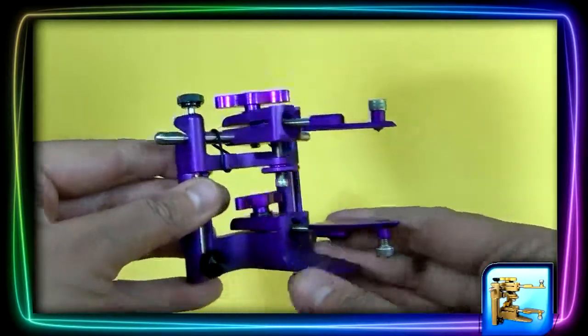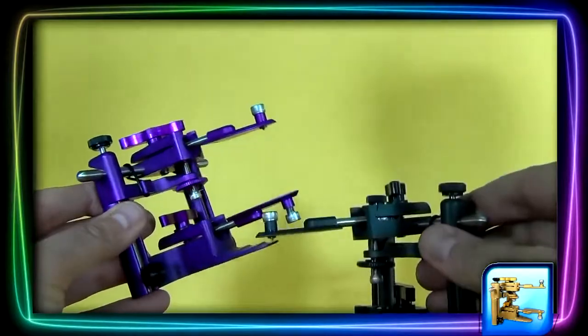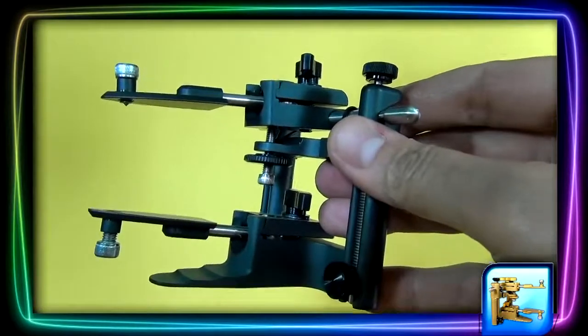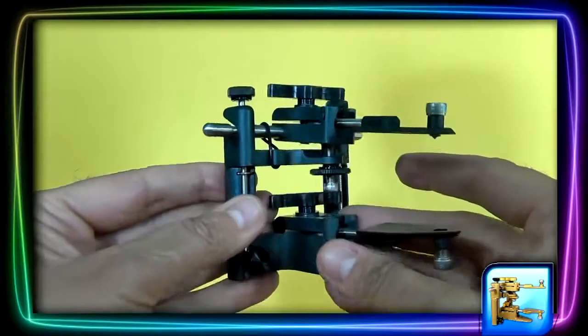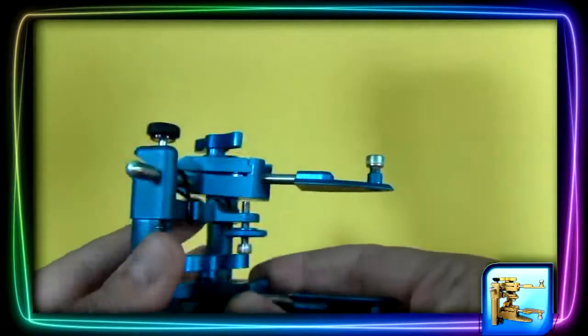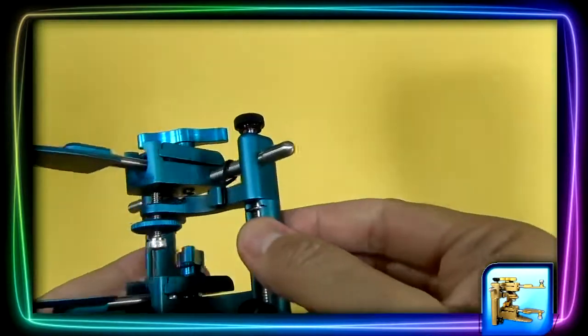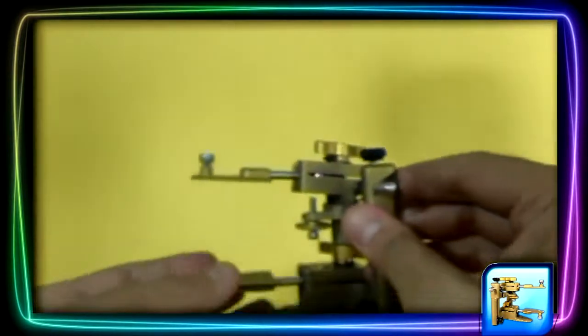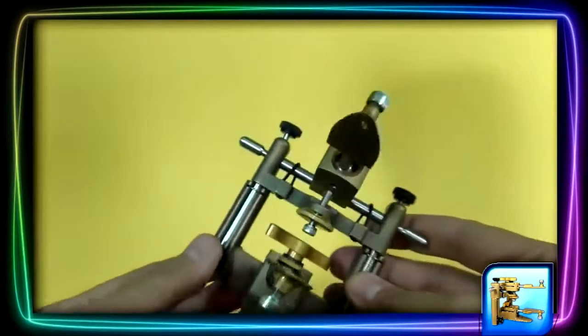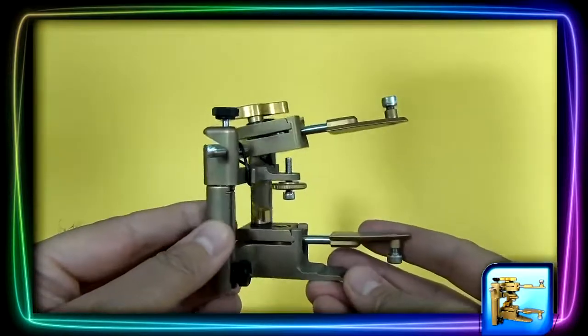Now, before I give you a demonstration, I'd like to introduce the variety of colors that the Enzo Articulator comes in. Here we have a black one. Our next color is a blue turquoise, which is very nice. We have one in gold. One in red.